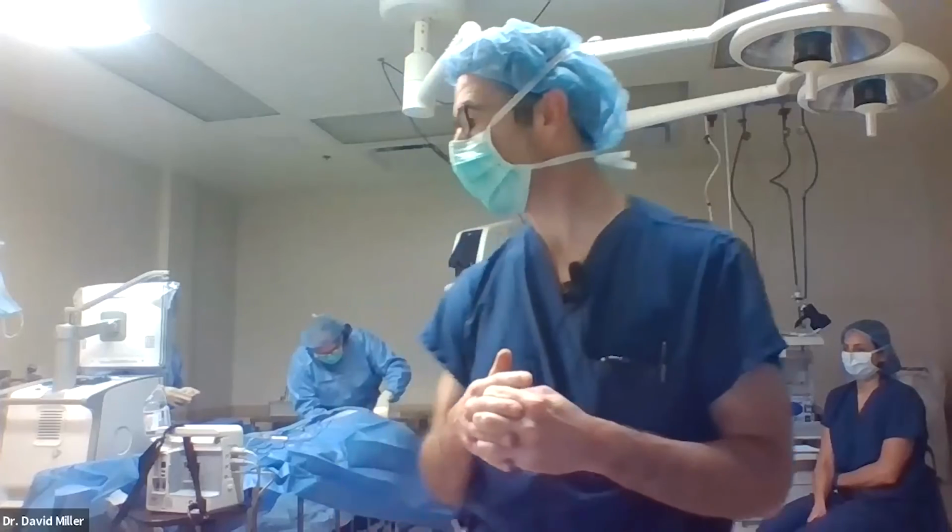Do I use any stains for these cases? Not in this type of case. I do use stains for macular holes and for epiretinal membranes. Typically, I use indocyanine green dye. I have used the blue stain also, but I prefer the green.